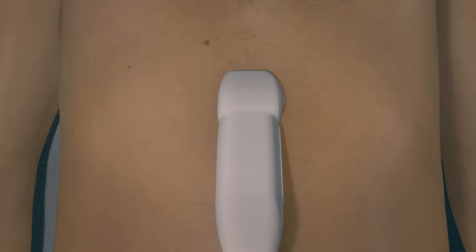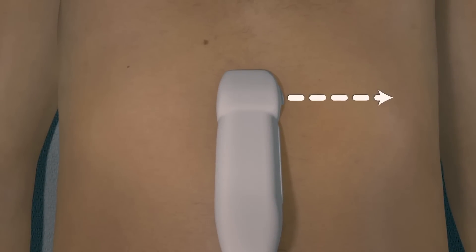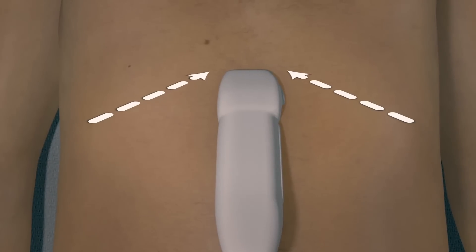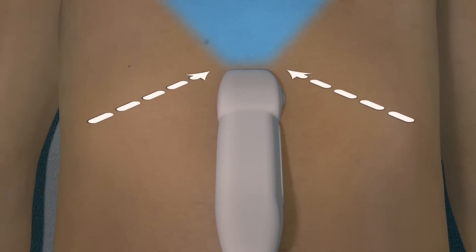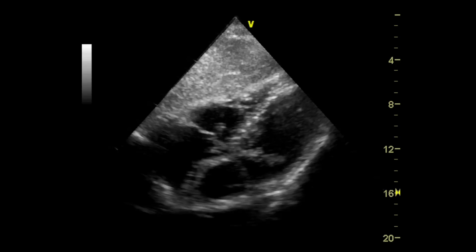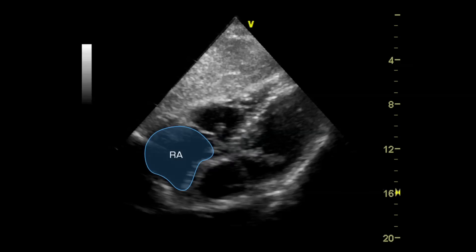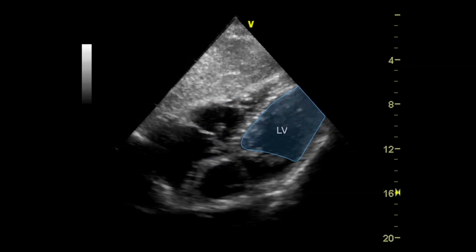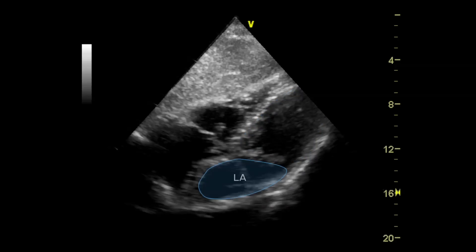To obtain the subcostal view, rotate the probe so that the probe marker is pointing toward the patient's left. Apply gentle downward pressure while aiming the transducer beam toward the heart. In the subcostal view, observe the position of all four cardiac chambers and both atrioventricular valves.